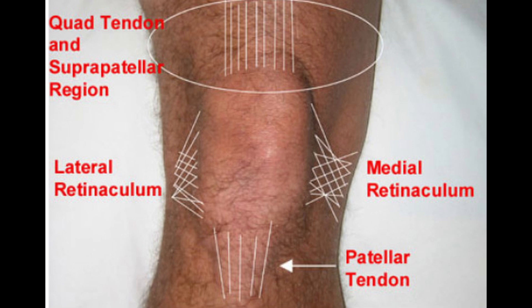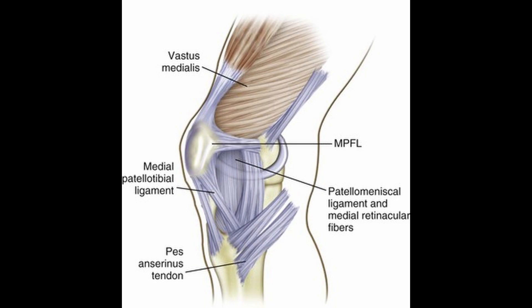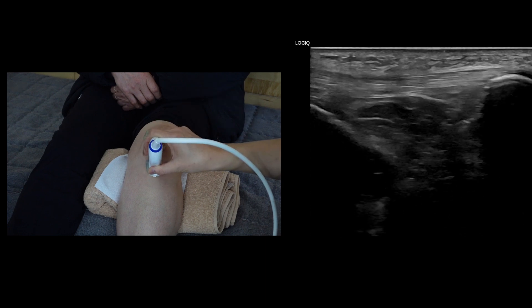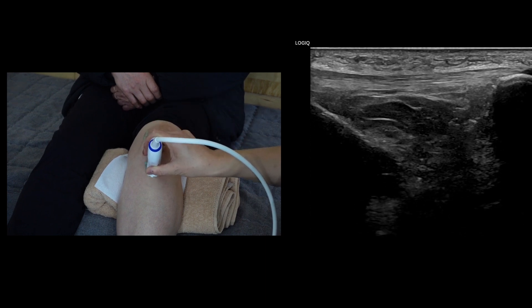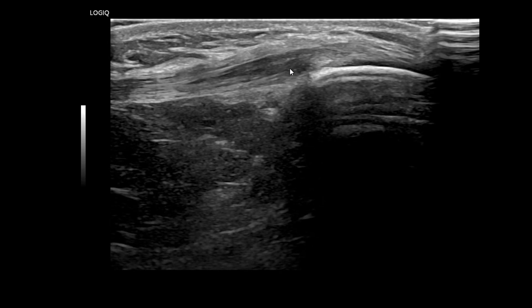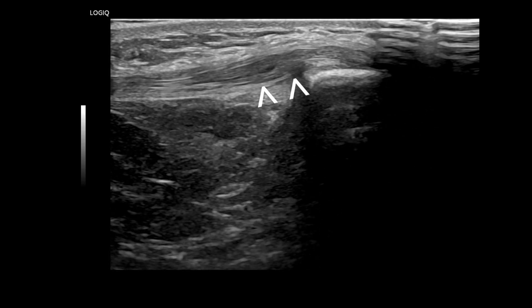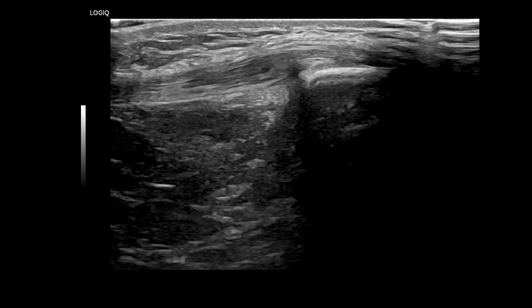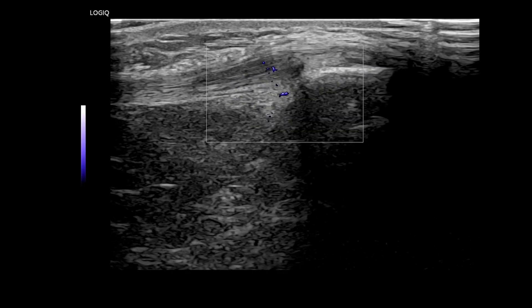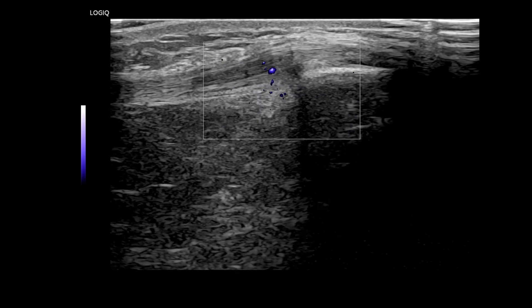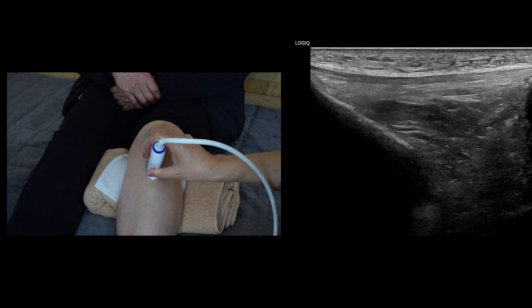The medial and lateral retinacula are placed on each side of the patella. They appear as bilayered structures indistinguishable from the underlying joint capsule. I typically do not examine these structures on a routine examination. Next, observe the infrapatellar tendon. In young athletes such as weightlifters or fencing professionals, this tendon may exhibit overused tears, commonly known as jumper's knee. Note that the lower pole of the patella has a V-shaped appearance, indicating that the patellar tendon inserts not only on the apex but also along the inferolateral and inferior medial edges of the bone. Deep to the patellar tendon is Hoffa's fat pad.